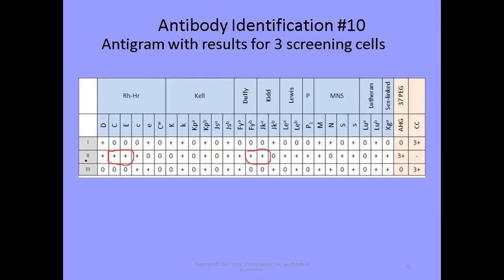So whatever this patient has, their antibodies are only reacting with antigens present on screening cell 2, so I hope you get what I'm doing. I'm looking for cells where screening cell 2 has the antigen, but 1 and 3 don't, to match this pattern of reactivity, just to get an idea of what it could be. This one, Lea. Well, that one doesn't usually react at 37 though. We wouldn't really know until we do the panel testing, and so we could see, okay, big S.